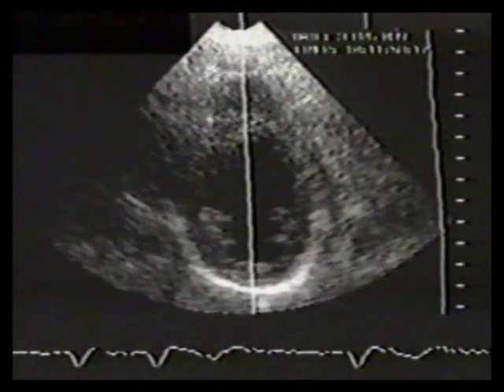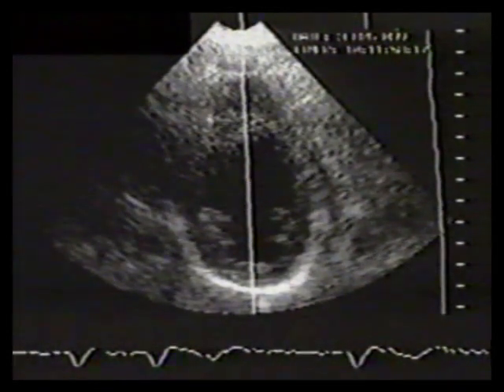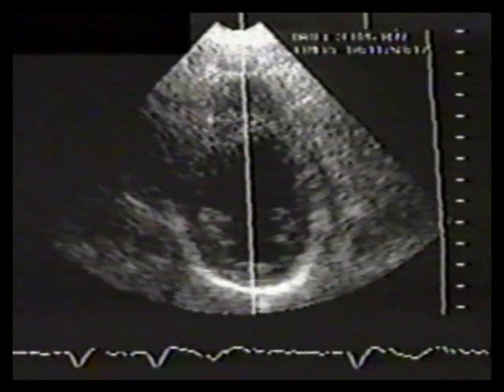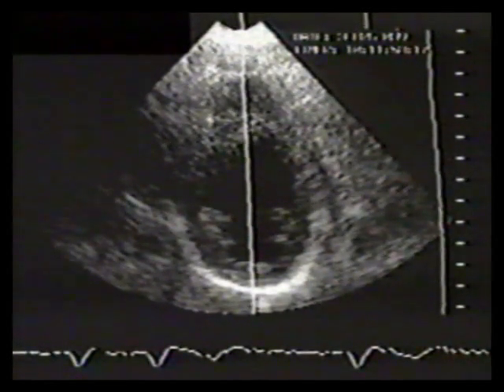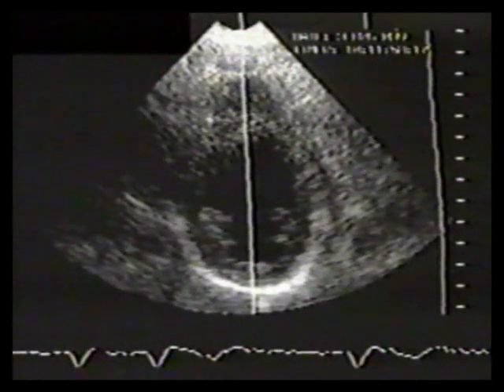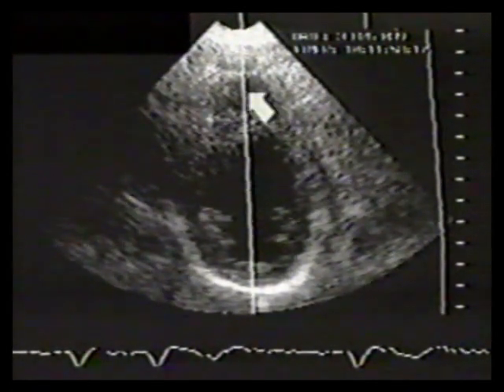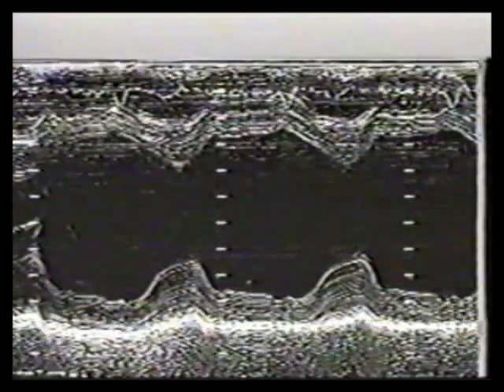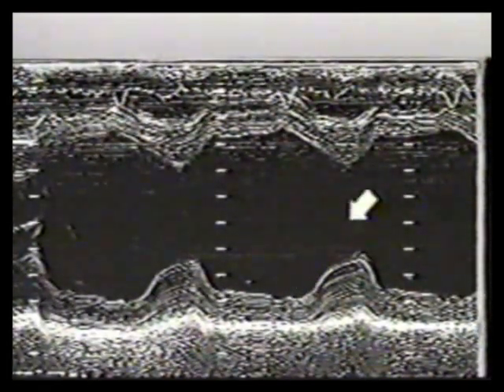For patients with mitral regurgitation, we still find that the 2D-derived M-mode from the mid-left ventricle is useful for determining left ventricular dimensions for serial follow-up. In this patient with mitral valve prolapse, the M-mode cursor has been directed across the left ventricle. The left ventricular cavity is enlarged, measuring 64 millimeters in diastole and 36 millimeters in systole.